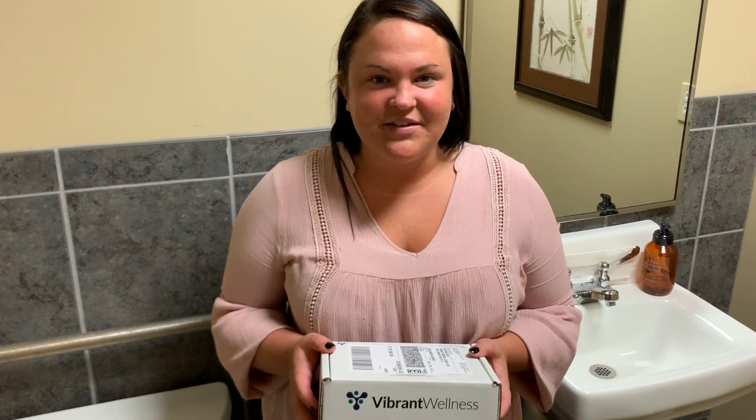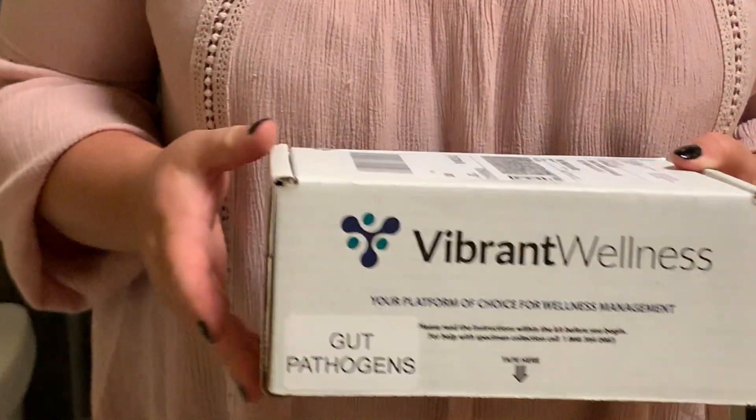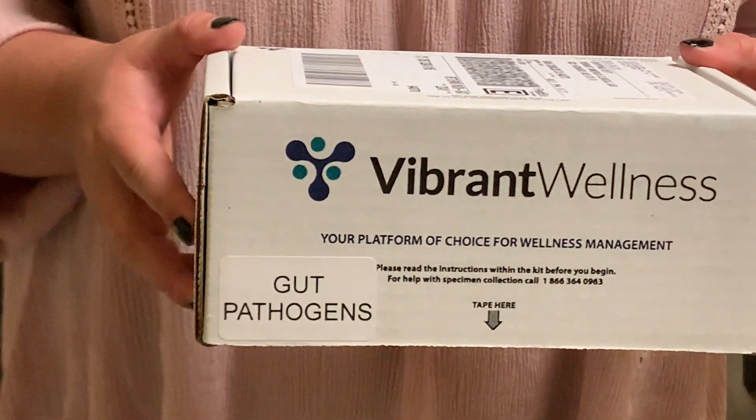Hi, this is the instructional video for the microbiome stool test, also known as the gut pathogen test by Vibrant America or Vibrant Wellness.